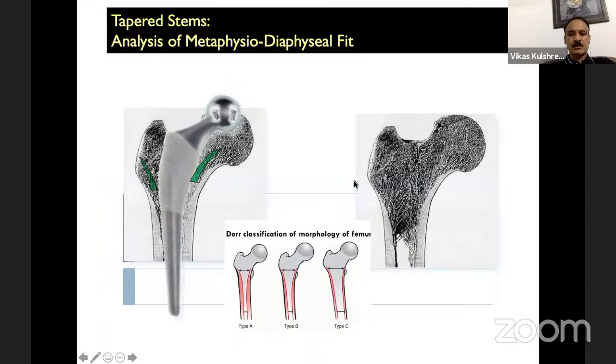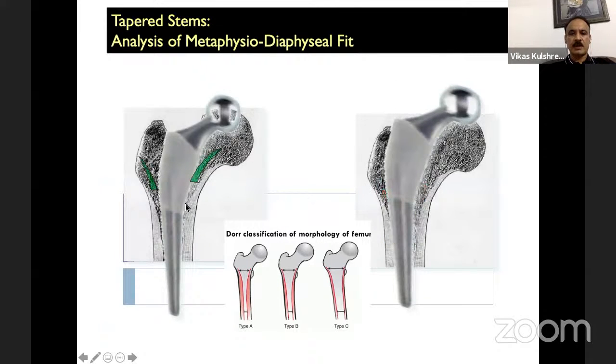Now, we have just shown here what happens when you don't prepare your femur properly, if the stem distal profile is not good. This is an Accolade design. I had the opportunity to study 400 such X-rays during my fellowship, at the time the Accolade 1 design was being reviewed. The problem we found was that in the extremes of sizes, when we were using size 1 or 2 or 6 and 7, a distal fit happened before the proximal fit. The good fit is here. It should sit into the cone, not allow any fit here. Some lucency you should see on both sides, showing that the distal profile has not engaged, and the engagement needs to be in the metaphyseal cone. If that does not happen and the stem hangs out, you will have limb length issues, you will have stress shielding, you will have thigh pain.